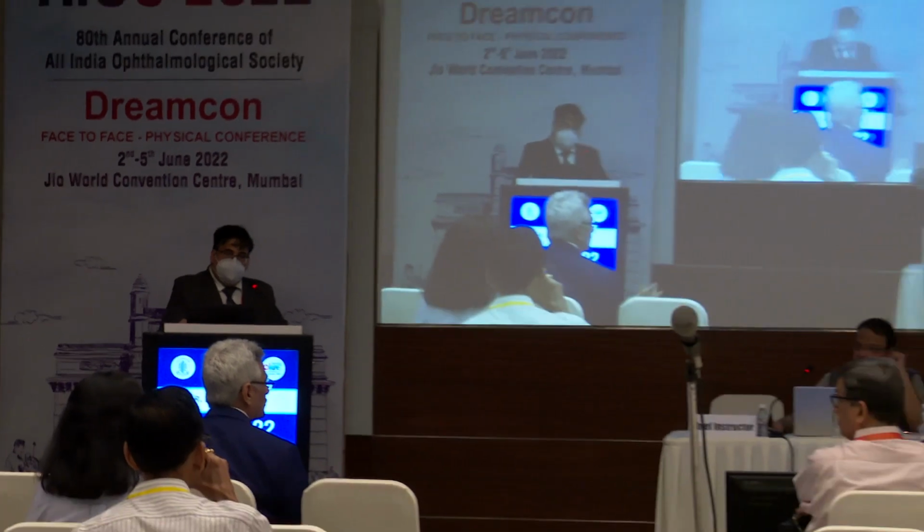Vitreous will not come out in 27 and 25. Yeah, 25-27 is not okay. Gel vitreous won't come out.